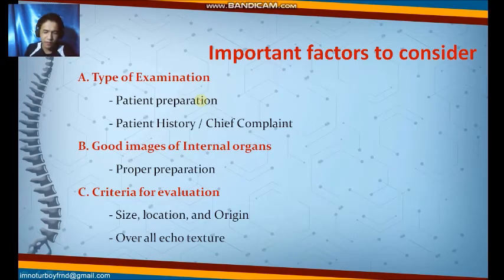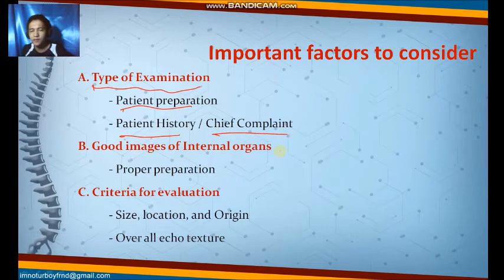Okay, so important factors to consider during an ultrasound examination or any type of examination. For any type of examination, important factors to consider, we have first the patient preparation. And then second is the patient history or the chief complaint of the patient.